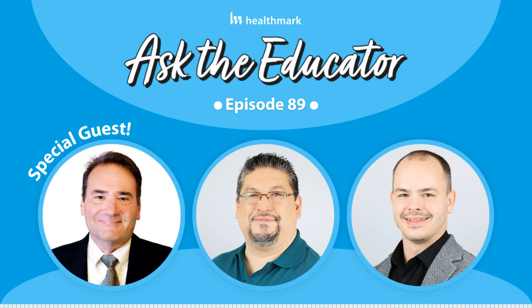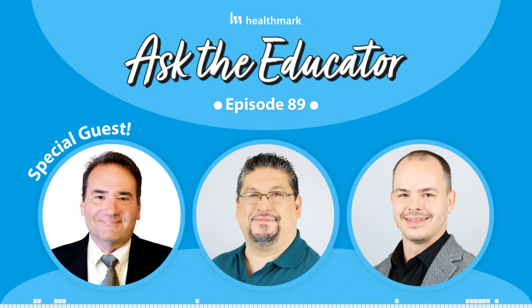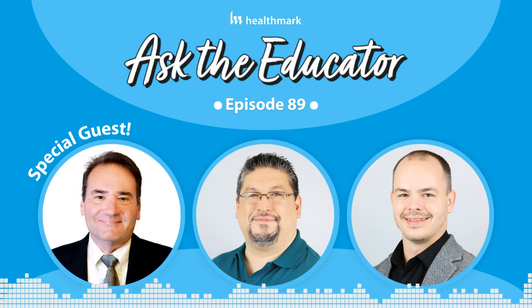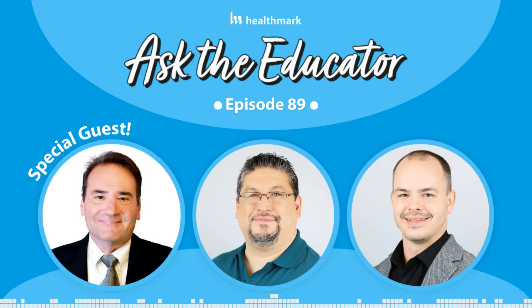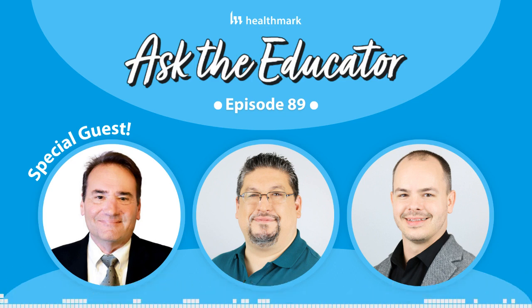Well, flexible reamers are really difficult to clean, so that's a great example of a really challenging device. And I can tell you, having worked on a bunch of these documents trying to describe worst case, I'll give you an example. Let's say the automated washer has a cycle with a 2-minute pre-wash, 4-minute enzymatic, and then 2-minute wash, and then thermal disinfection for rinse for a period of time. The device manufacturer gives you a range of times, and you have to test the shortest time. The cleaning agent manufacturer might give a concentration between 1 ounce to 3 ounces. You need to test at that 1 ounce. That would be the worst case.